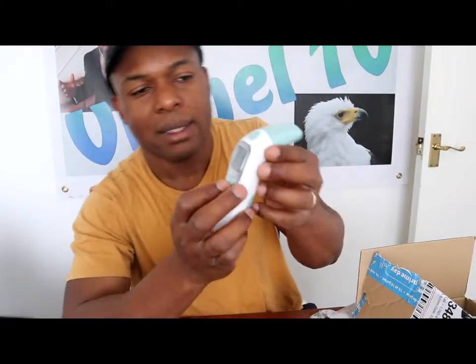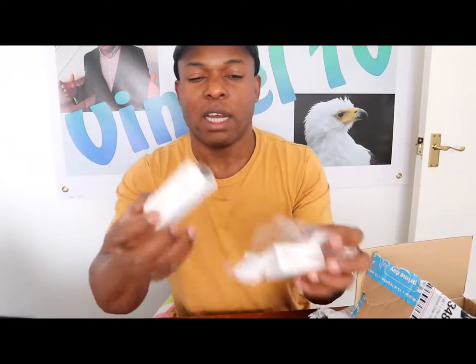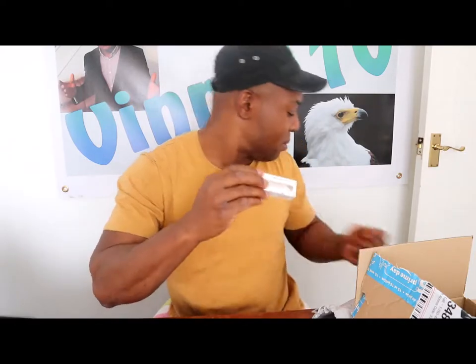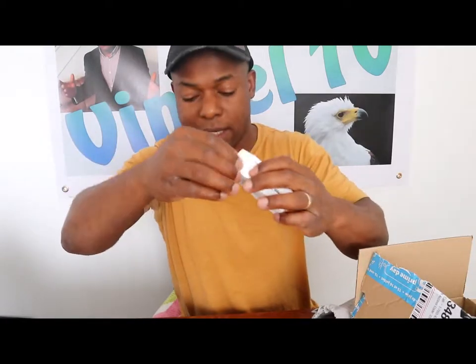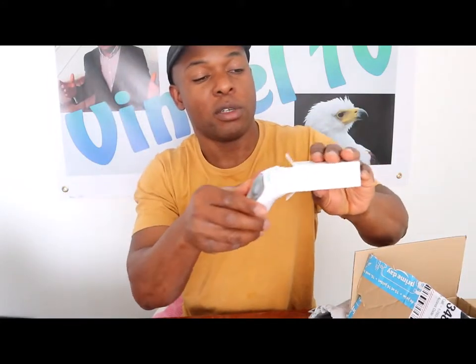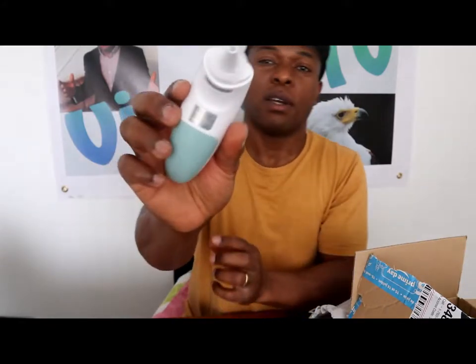This is great equipment every family needs to have. Now I'll show you the probe — this is the probe cover. The purpose of this probe is to take the probe and attach it. You can put it in your ear or on your tongue. Take this off, pull it out like this, then put the probe on. The probe is on — now put it in your ear and press.